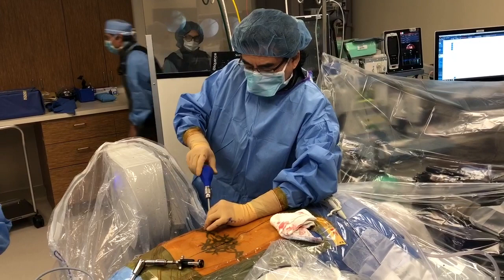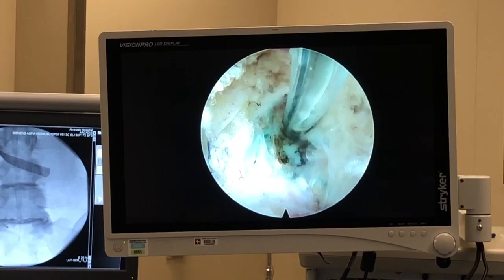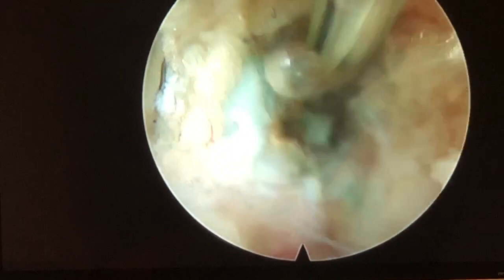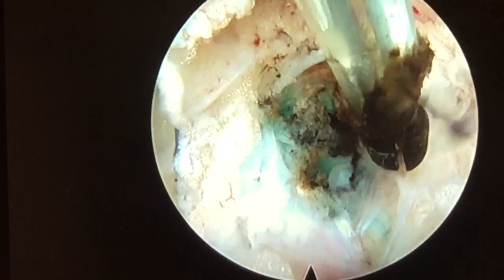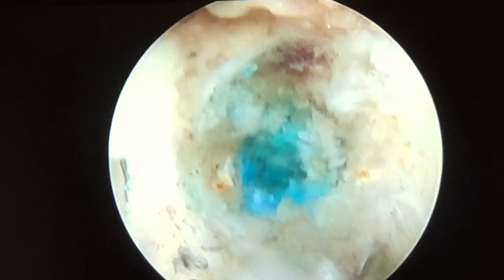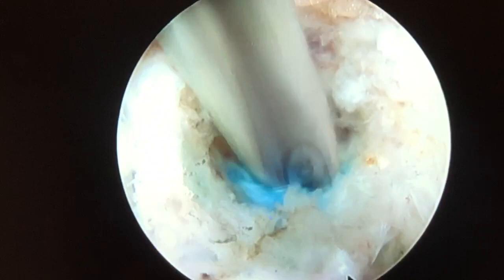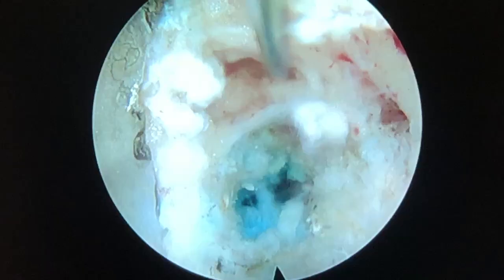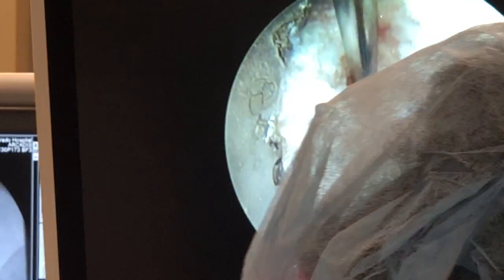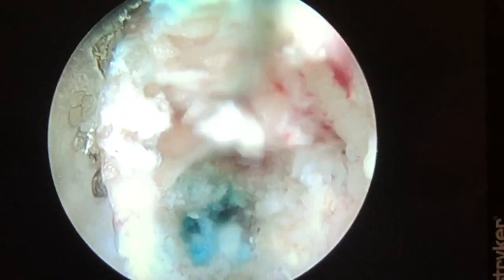Yeah, look at that — shot. I'm looking for that tear. Not only that, but the tear also lets the electricity conduct. I was thinking this level doesn't look that bad, but I take that completely back now. There's a little bump right there — shot. Yeah, there's something right there stuck — oh yeah.